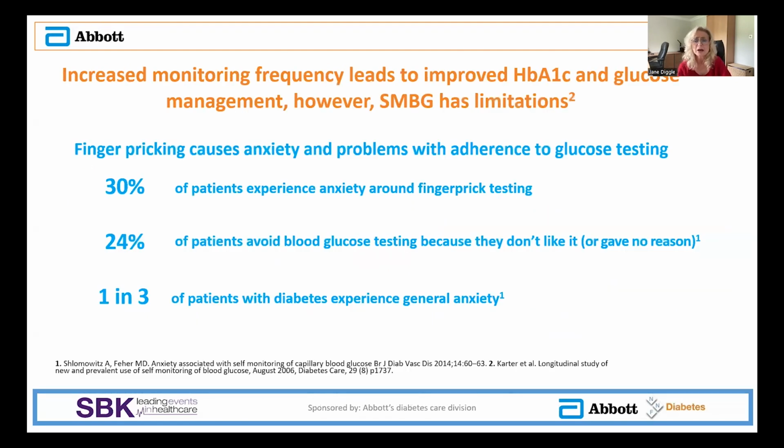So of course we encourage people to do frequent finger prick testing, sometimes, you know, as much as 7 or 8 times a day.